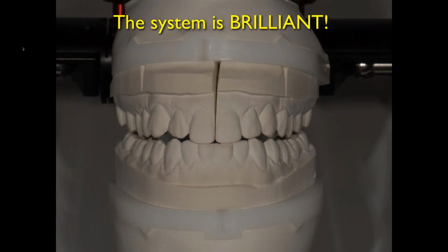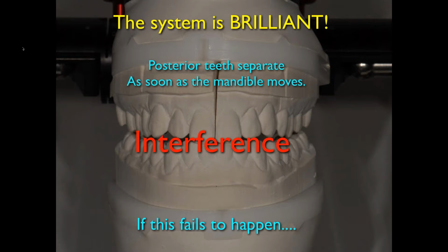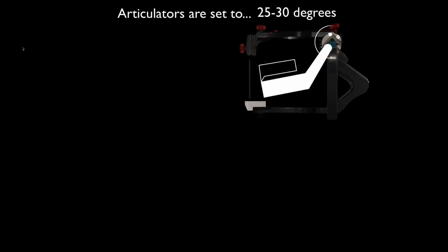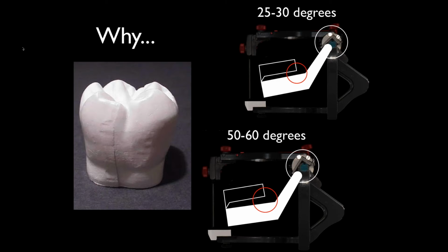The system really is brilliant, okay, that the posterior teeth separate as soon as the mandible moves. But if this fails to happen, we get interferences, and those can be quite destructive, okay? So articulators are set to 25 to 30 degrees, typically. A human skull is more like 50 to 60. We talked about this before. Why? The reason is that if we have less condylar guidance, 25 to 30, we get less posterior disclusion. And there's some implications to this.